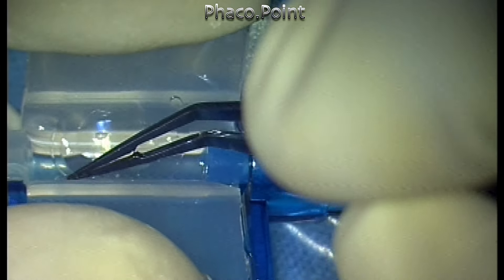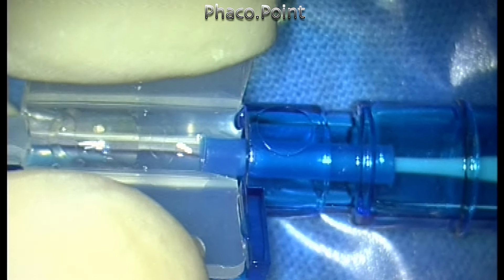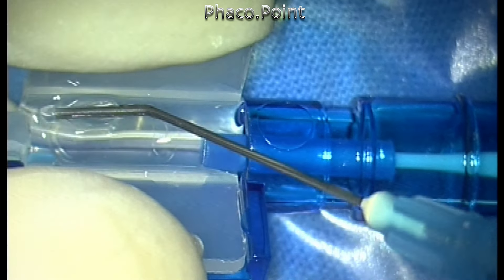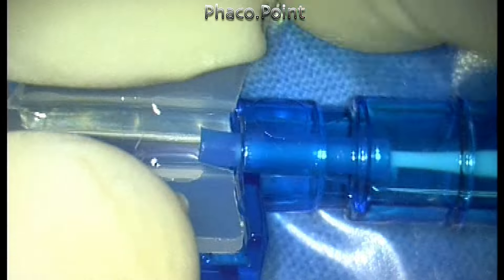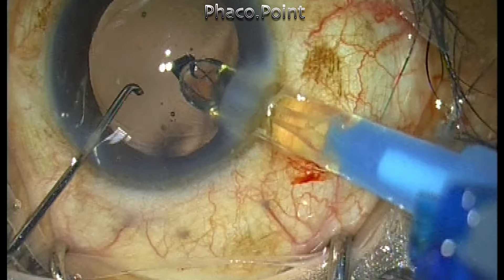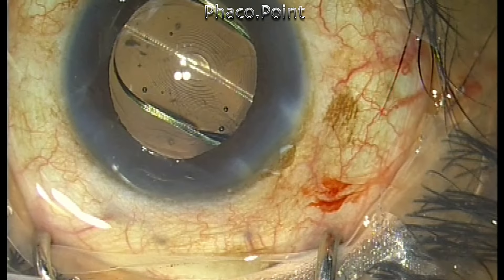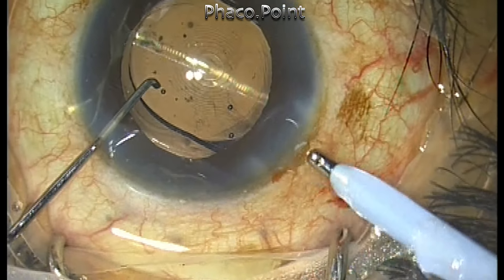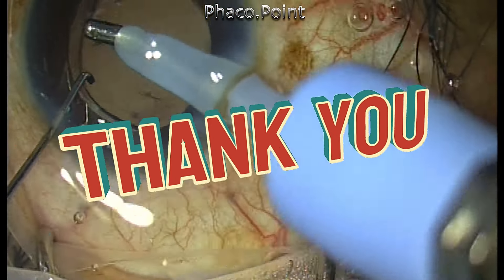The hydrophobic acrylic material is extremely sticky, so the lenses tend to get stuck to the cartridge. Simply putting viscoelastic alone will not solve the problem. You must first put a little amount of balanced salt solution and move the lens — either pick it up or just move it within the barrel — before putting viscoelastic and loading it. Then the injection will occur smoothly and easily. This is the single most important step I have learned with these indigenous hydrophobic acrylic lenses. Thank you for your attention.